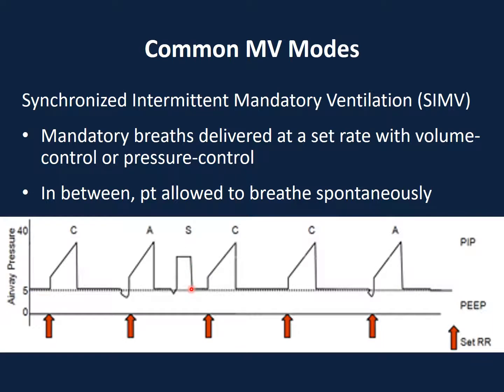As I mentioned also before, every pressure type ventilation is almost always a square wave. So there's a dip here that refers to the patient triggering the breath, and then some support is being given by pressure. Okay, so in this graphic, this is a volume control breath. That looks like a shark's fin or a triangular type of shape. Volume control breath, and then spontaneous breathing, square wave, pressure supported breath.